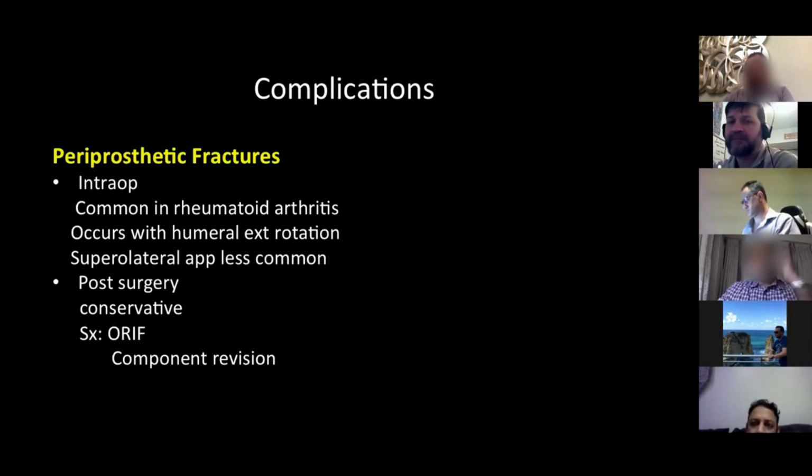Post-surgery humeral shaft periprosthetic fractures may be treated non-surgically if the implant is well fixed and the fracture line is located at or distal to the tip of the prosthesis. Otherwise, surgery is required and may involve internal fixation with cerclage wires, plates, and bone struts, with or without revision of the humeral component.